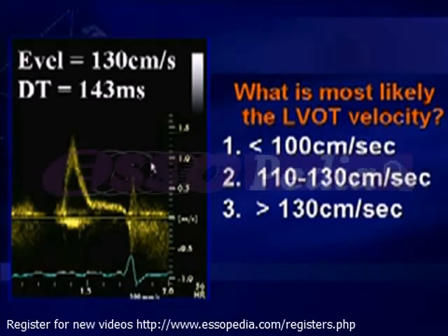Therefore, the mitral E wave to LVOT velocity ratio is about 80% in younger individuals, decreasing to 70% in middle age, maybe 60% in the elderly, as LV relaxation slows and the E wave velocity decreases. A ratio lower than expected indicates impaired LV relaxation and normal mean LA pressure.